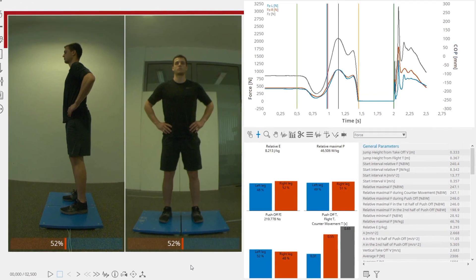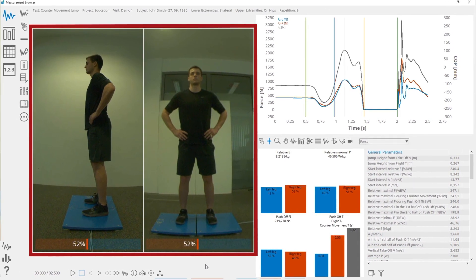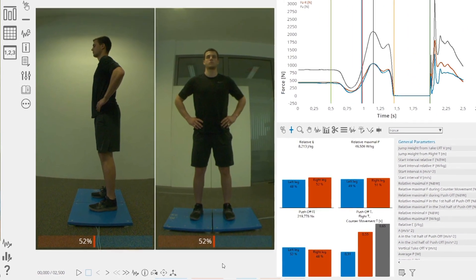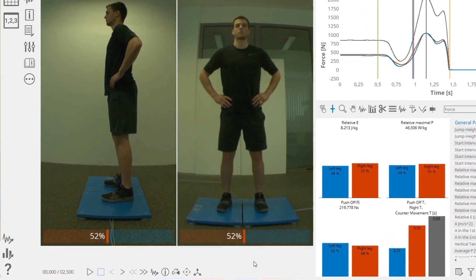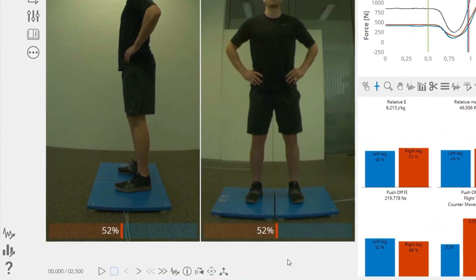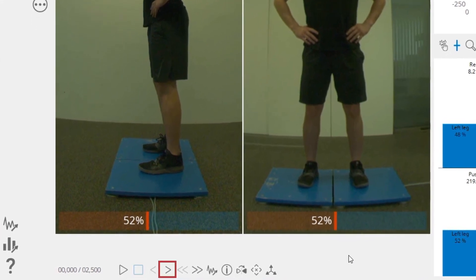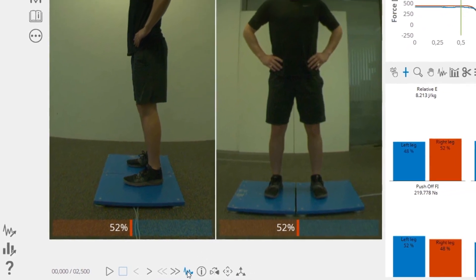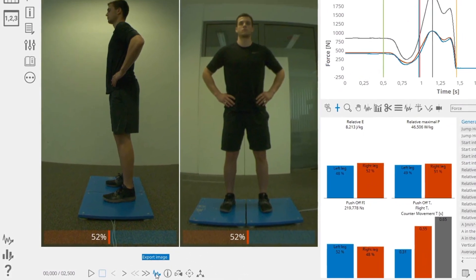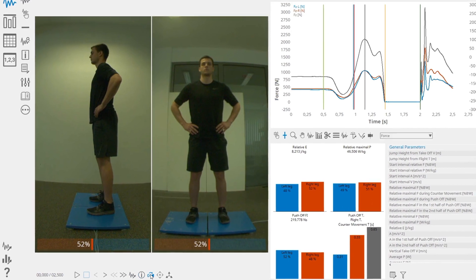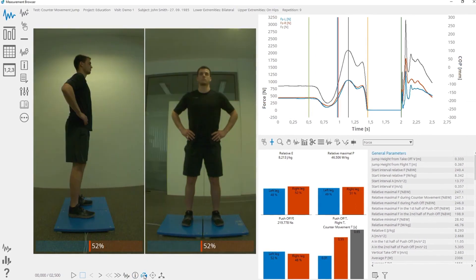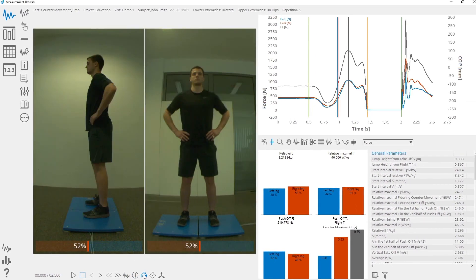A video will be shown if a camera was configured when the measurement was acquired. Below the videos, you have some basic controls for manipulating the video, such as Start, Stop, Skip Forward, Skip Backwards, etc. You can export the current image of the video by clicking on the Export Image button. You can flip the image over a vertical axis by selecting Flip Image.